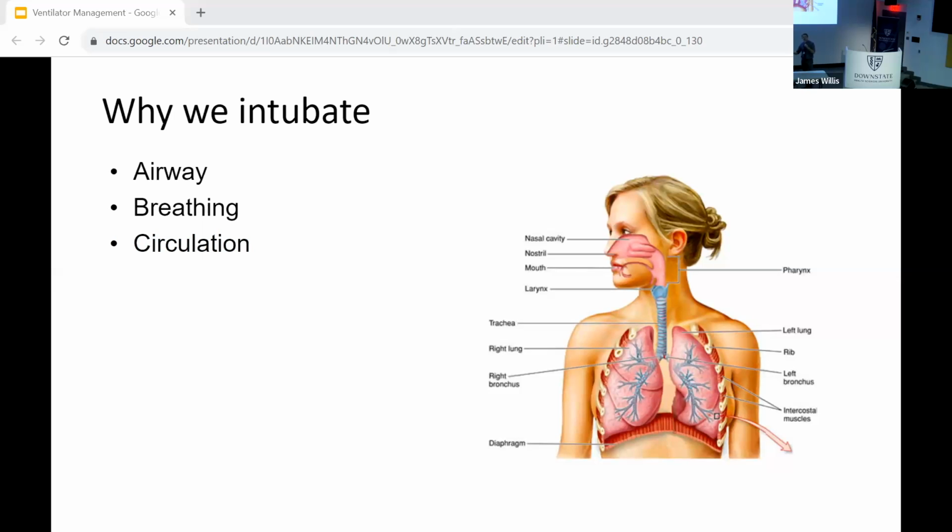Circulation, shock, metabolic acidosis. Some of these patients are also going to be difficult to ventilate. Airway management physiologically may be difficult. If you think about the fear of intubating a severely acidotic patient, think about that. But the ventilator management has some nuance, and we'll discuss that.